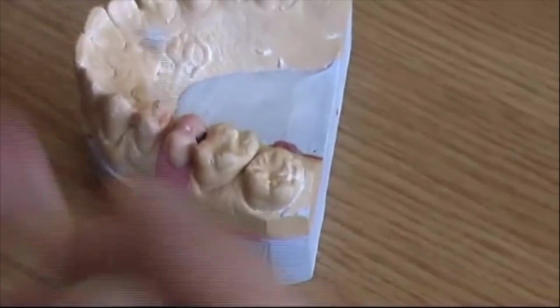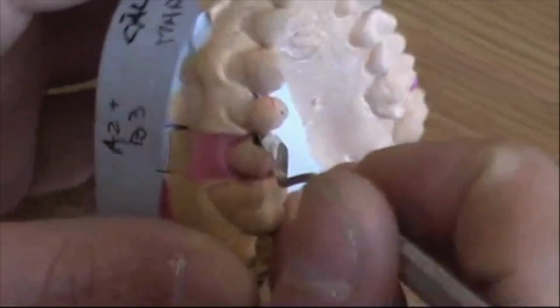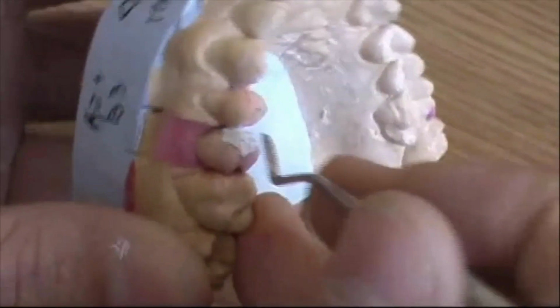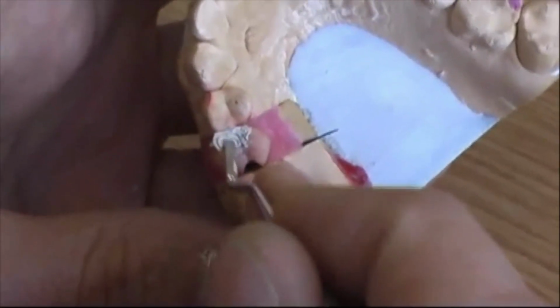So here we imagine that we have a tooth that has two cavities. You see, we do a temporary filling. Why? Because once we have trimmed everything, we need to do a temporary crown there. So now this is a cement, a temporary cement. So you just imagine we're in the mouth. Imagine this is the mouth of the patient.